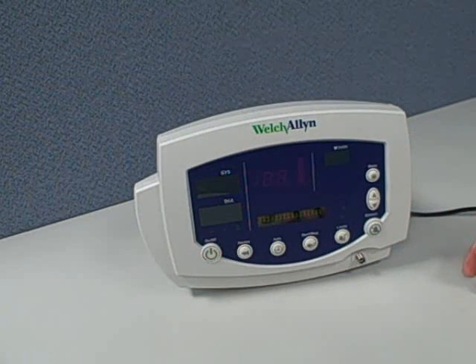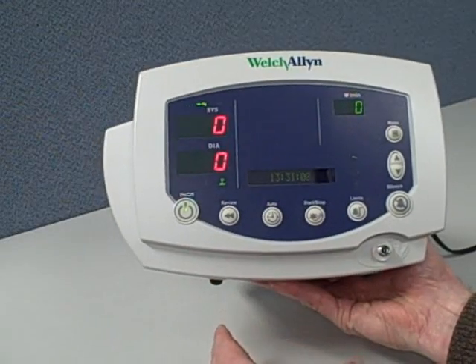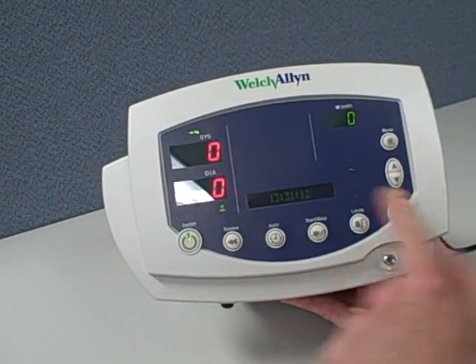This is a basic model that we're looking at, with NIBP, blood pressure, and heart rate. Also available as options are pulse oximetry, temperature, and a built-in printer.